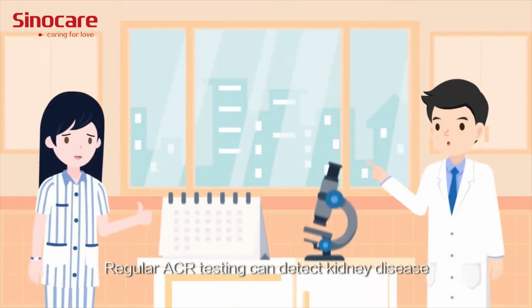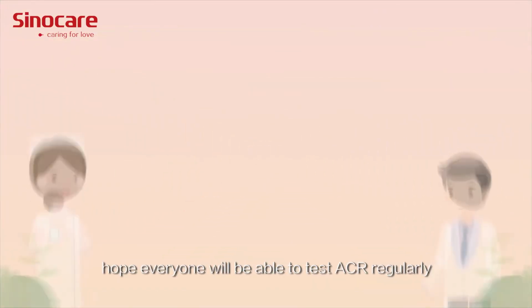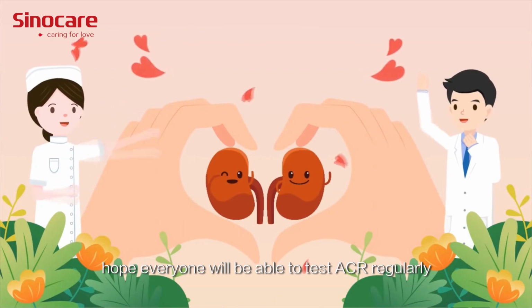Regular ACR testing can detect kidney disease at an early stage. In the future, we hope everyone will be able to test ACR regularly.